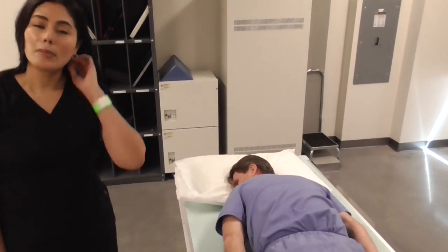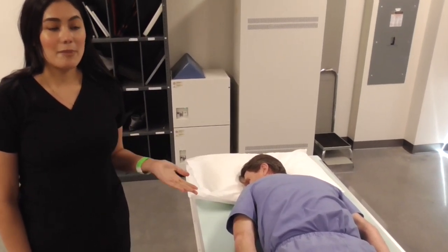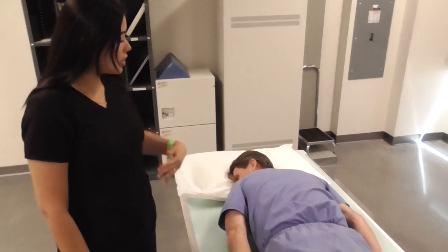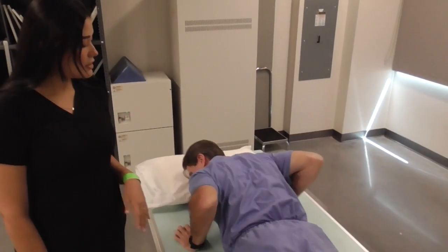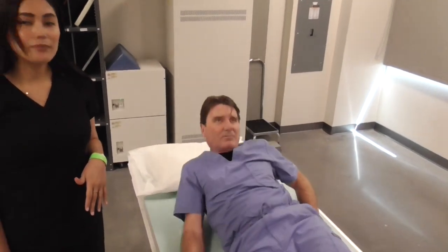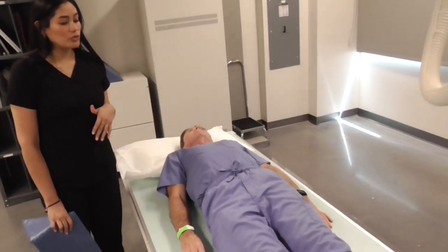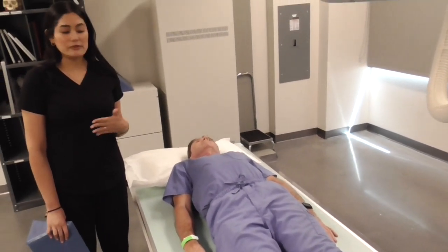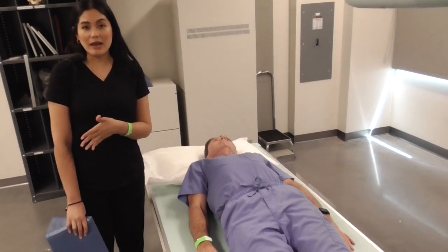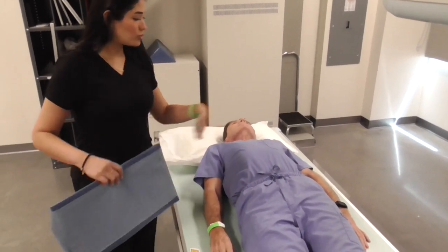So now we're going to do some oblique positions. We are going to do our AP obliques. I'm going to have you on your back again in the supine position. We are going to do an RPO — right posterior oblique — meaning the right side will be closest to the IR. So I'm going to have you roll towards me.